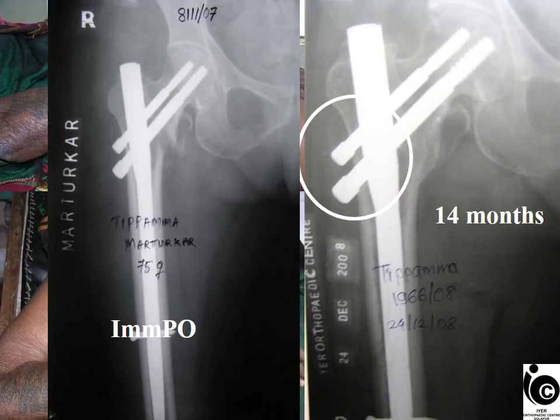In the immediate postoperative period and after 14 months, there is no change in the position of the screw. It is not backed out. The fracture is consolidated. So all the compression the fracture was begging for, I have achieved on the table.